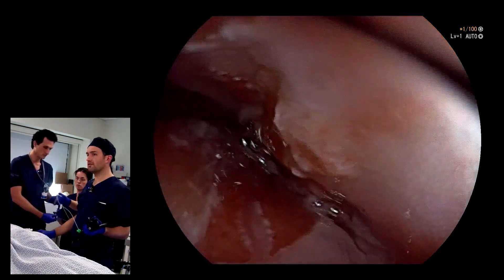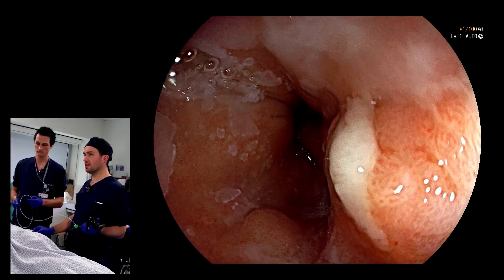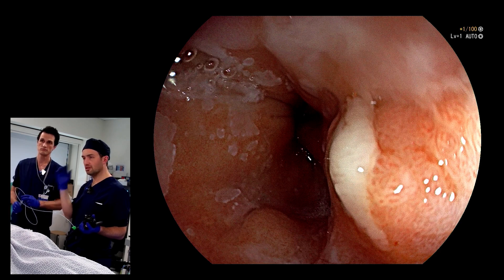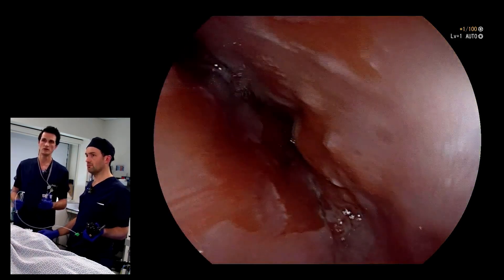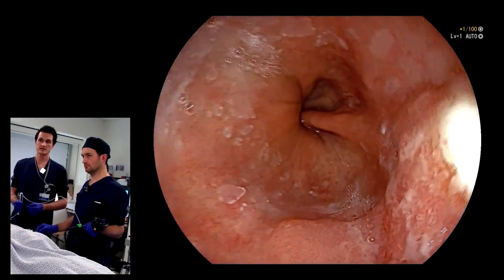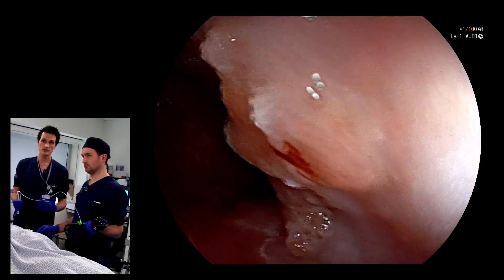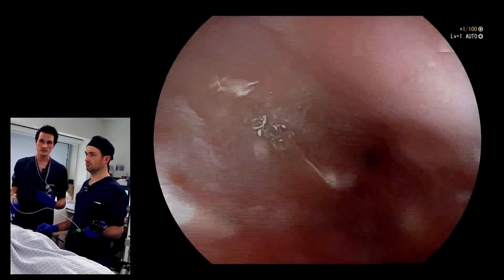Let's just look a bit at that fibrin. A lot of people call this ulceration — you'll get people that say that's ulcerated, that's for surgery. Do you agree? No, not necessarily. What would we need to do? I think we need to be sure that it's local, so we need imaging. We have that in this patient — we did a PET-CT scan last week, and that didn't show any lymph node involvement, nor metastatic disease. And then there's some discussion on whether you want to do EUS or not, because actually an excisional staging is also a possibility.